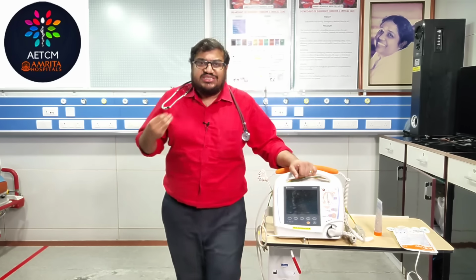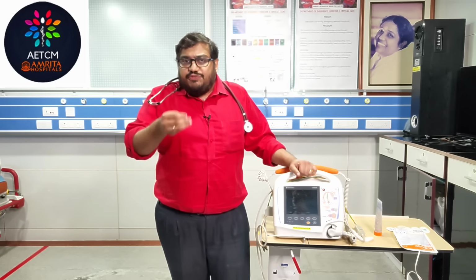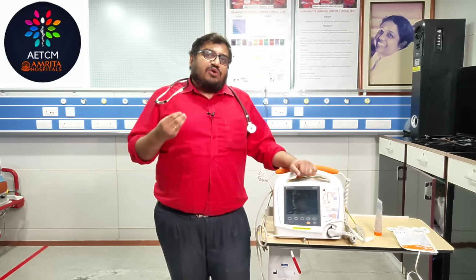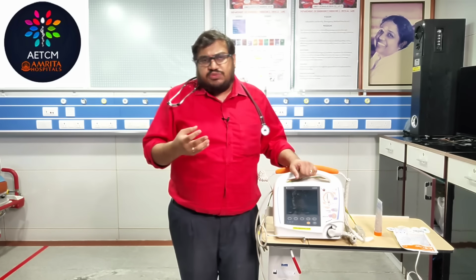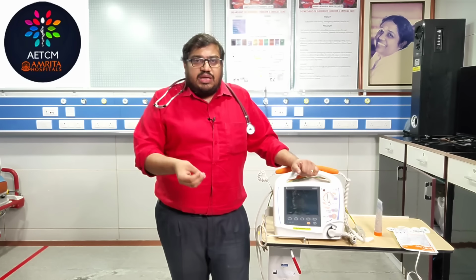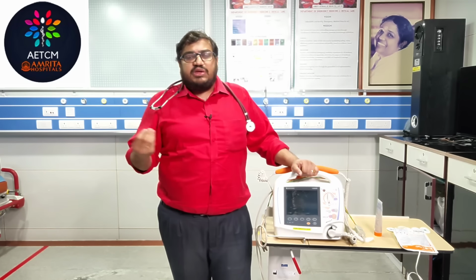Cardioversion is not just a simple procedure. You have to have a little bit of knowledge regarding cardioversion, and in different scenarios you need to select different amounts of energy. First of all, what are the requirements for a cardioversion? For any procedure, you need to have a consent. You need to tell the family and bystander that I am going to deliver a shock, maybe we need to sedate him.